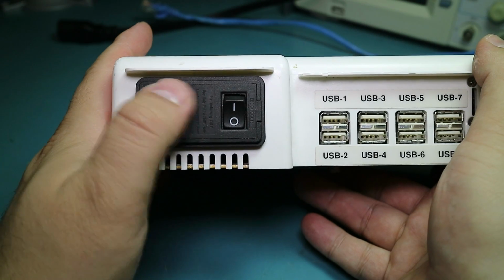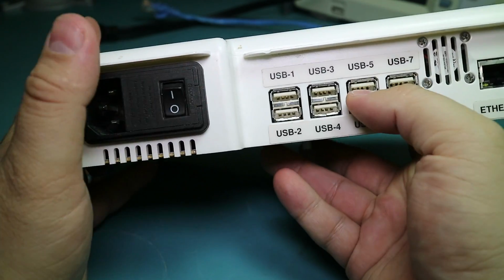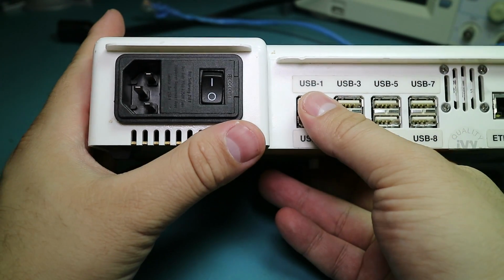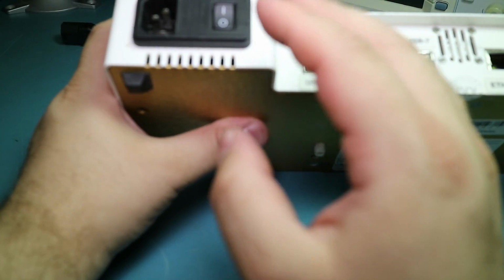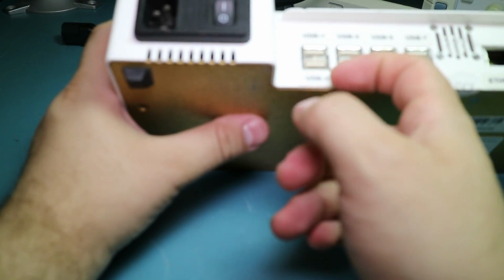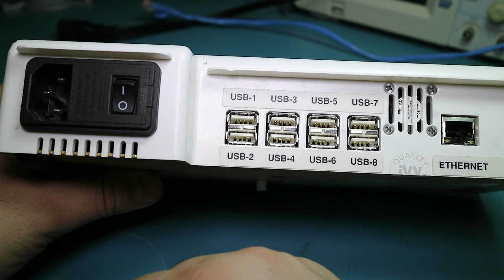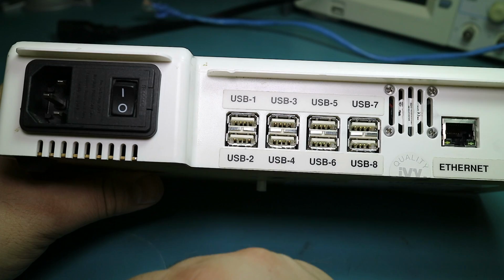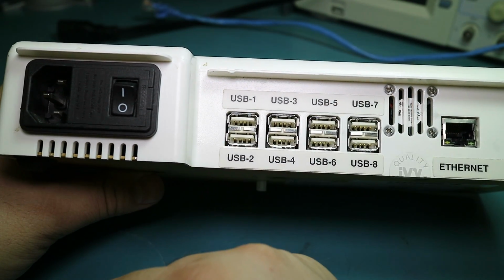This doesn't look hospital grade. I think this is just like a nice power connector. It's nice quality, but it doesn't look like this is all designed to be near a patient. And from how I've described it and how I've seen it written, it looks like this is really meant for like reception. Because when I purchased it and it said it was a medical device, I was expecting a lot of really over the top safety stuff, but first of all, you're using USB, so I don't think it's all that intrinsically safe.